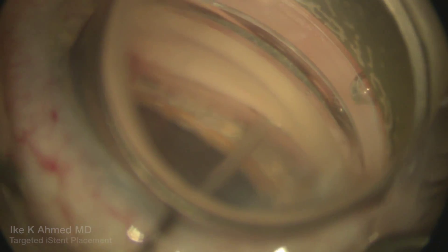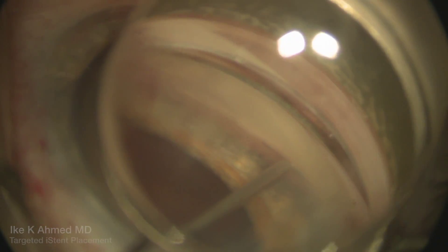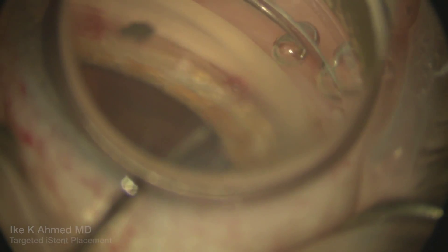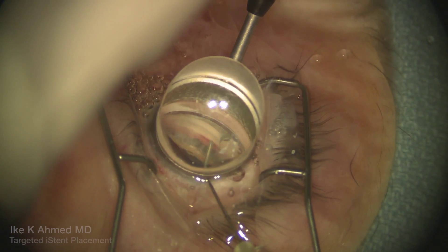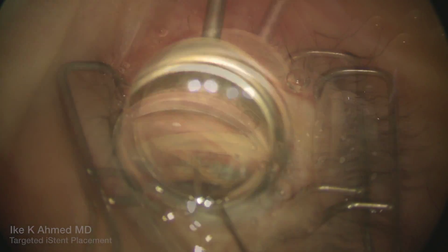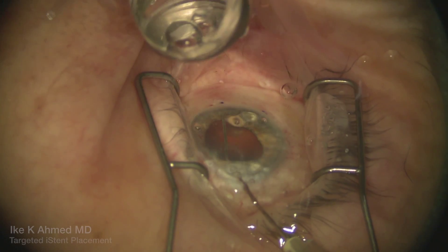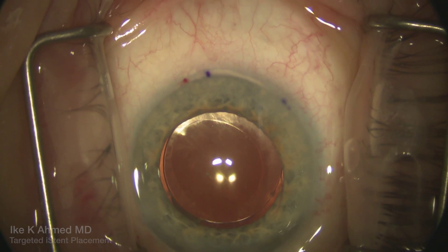The second device is placed here in the supranasal quadrant, nearby where we feel that aqueous vein was present. You can see the position of that device is just slightly superior to where those marks were placed. The inferior infranasal one is placed basically right on where that mark was present.